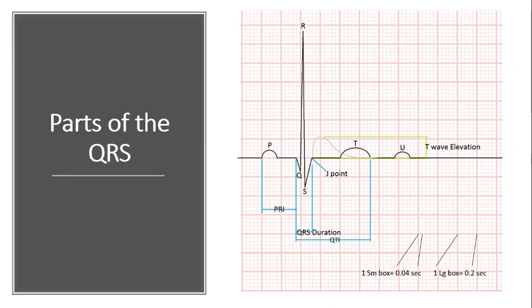The ventricles get this electricity going through them. They contract, and then you move on to the T wave. T is repolarization, resetting of all those cardiac cells for the next complex. So we'll start with the P.